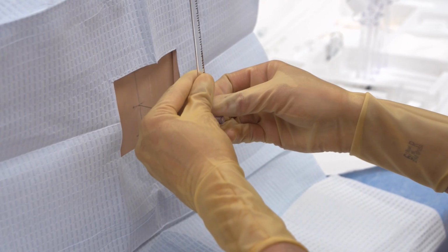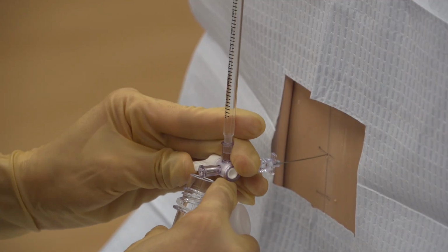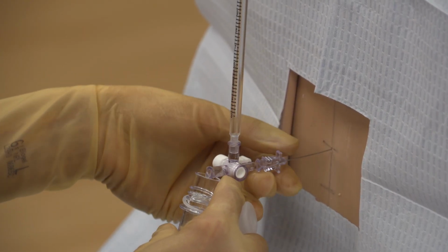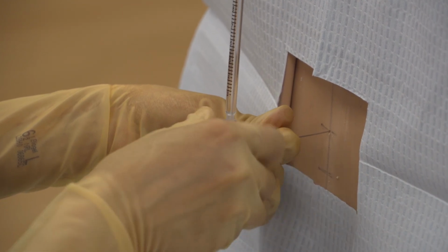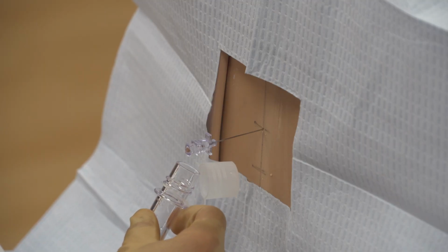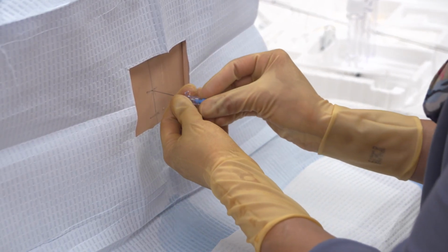To collect the CSF from the manometer, place tube 1 at the opening of the 3-way stopcock. Rotate the lever 180 degrees towards the patient. CSF will flow out of the manometer and into the tube quickly. Remove the manometer complex, and please note, always maintain control of the spinal needle while removing the complex. Sequentially fill CSF tubes, aiming for 2 to 4 mL per tube depending on the indication. When the desired amount of CSF is obtained, replace the stylet completely.